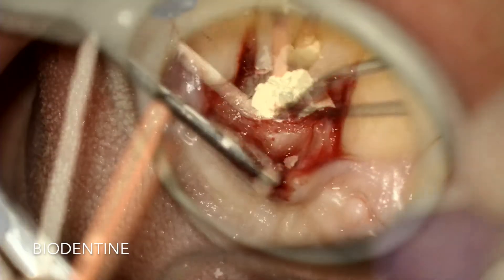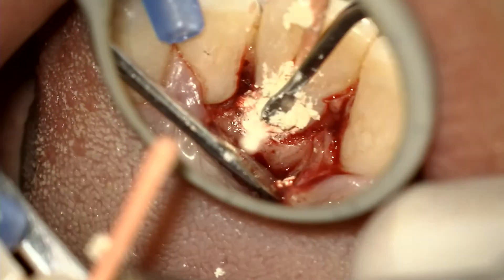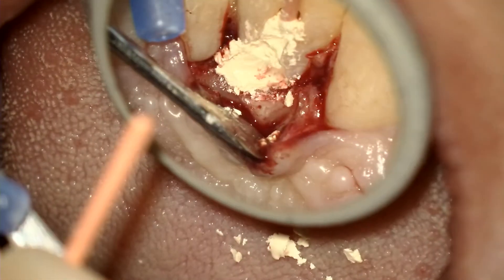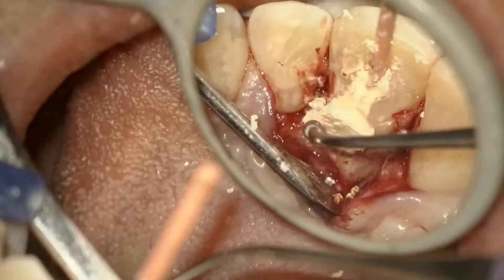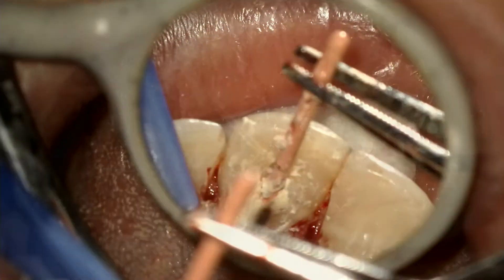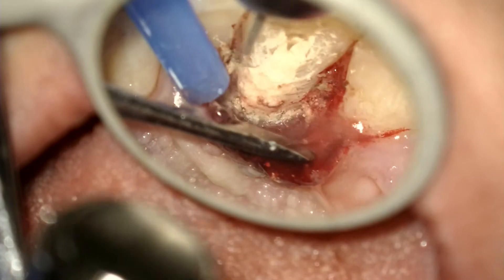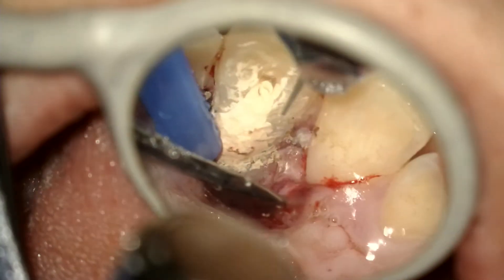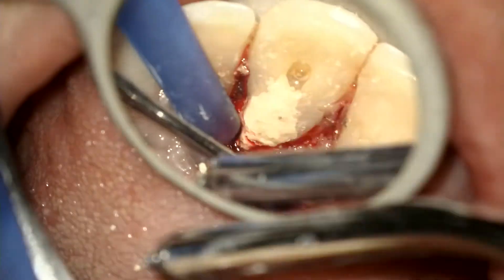We filled the cavity with Biodentine in different layers. A GP cone was inserted into the canal to avoid filling the canal with Biodentine. Once the Biodentine was set, we polished it.